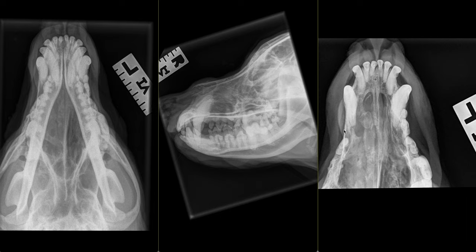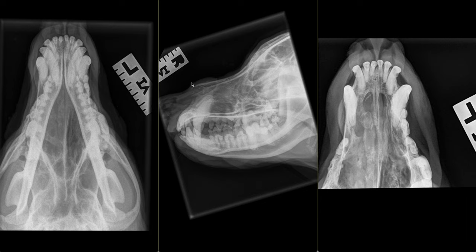Several teeth are missing: tooth 105, 106, and 108. There is moderate expansion of the periapical or periodontal space surrounding both tooth 104 and 107. On the lateral view, we observe irregularly marginated lysis of the rostral maxilla. If this was along midline, we would consider the nasal bone. Dorsal to this change, and consistent with the described soft tissue swelling, there is a soft tissue bulge and deformation.